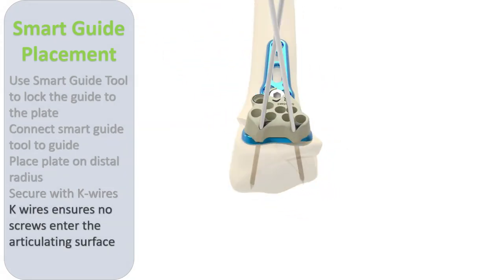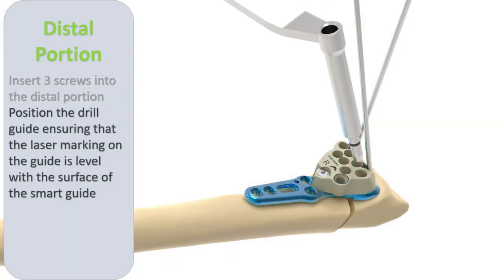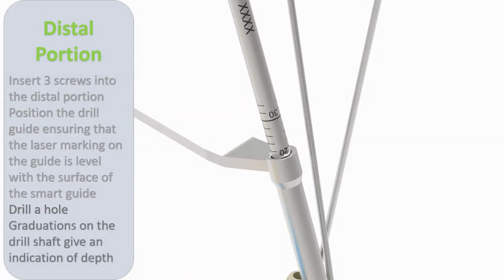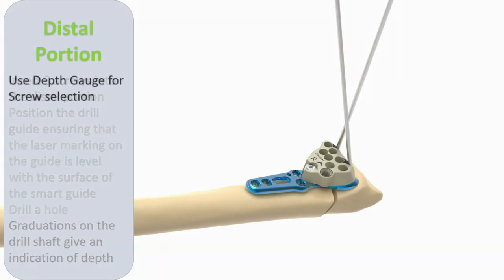The plate can then be provisionally secured to the distal radius by K wires through the appropriate distal holes. The drill guide is placed into the smart guide so that the laser marking is level with the surface of the smart guide. With the drill guide accurately placed, the markings on the drill shaft give an accurate representation of the drill depth.